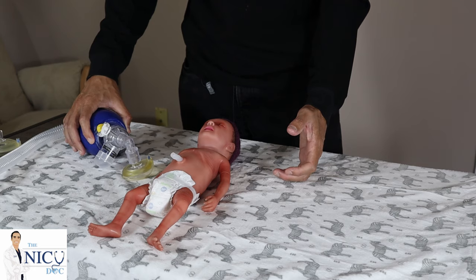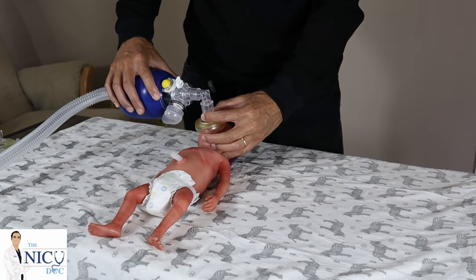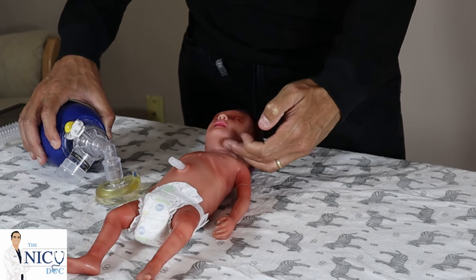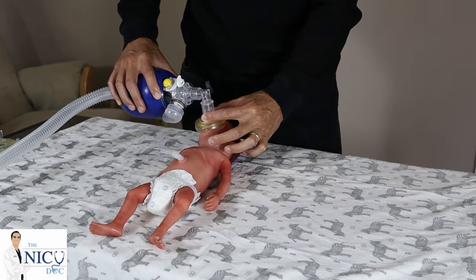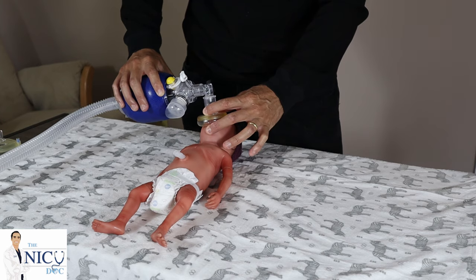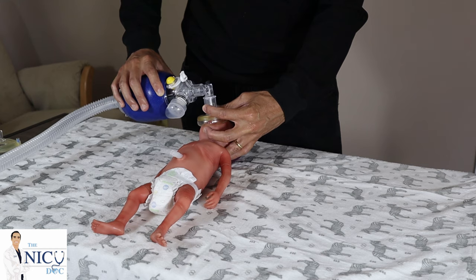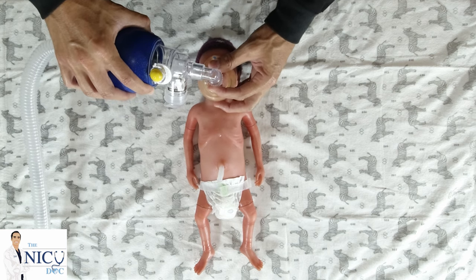For older children or larger babies, you can use the CE grasp: a C shape on the mask and then three fingers at the area of the chin. However, in the mandible of a preemie there's not a whole lot of space. Therefore, I basically call it the CI — you have your C hold and then just one finger to extend and lift the chin slightly. You can use your other fingers in the back of the neck to extend it a little bit. You're lifting the chin to open up the area of the glottis and using your C to get that nice seal — like a CI.